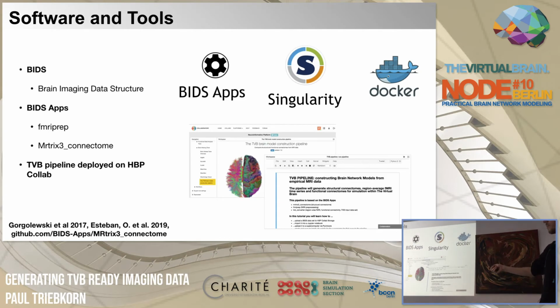So there are people who created containers, either Singularity or Docker, and they work on this folder structure specified by BIDS. And then it's pretty easy at some point to just acquire data, store it in BIDS, and then use some Docker which has been tested, which has been validated and has many functionalities, and to just move your BIDS dataset into this container, and you get an output. The aim here is to make this preprocessing and image analysis more reproducible and more robust, so that the neuroscience, neuroimaging community takes similar steps when preparing their data.